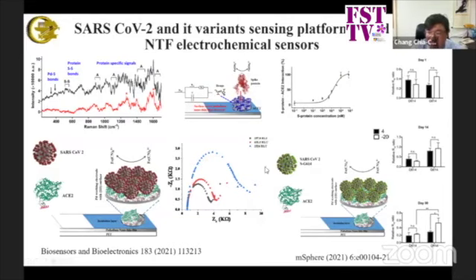At the same time, we could also detect some mutants, such as the European strain. My collaborator, Professor Si Ru, thought that since we have this kind of detection instrument, we could test whether those viruses are still active after cold storage.